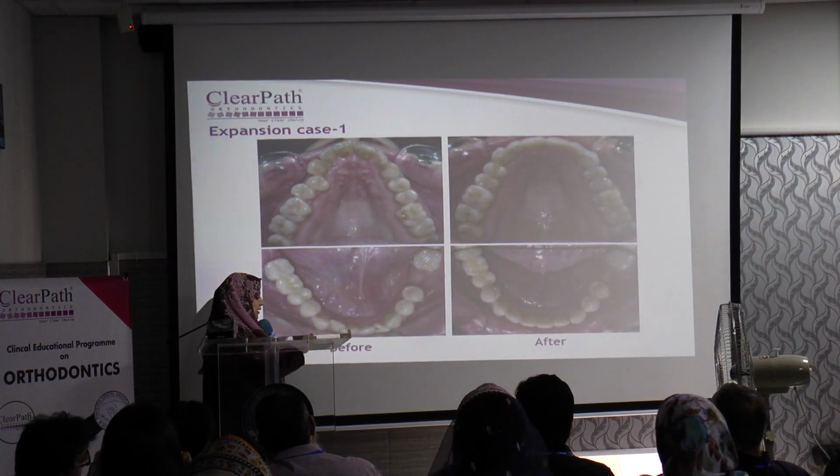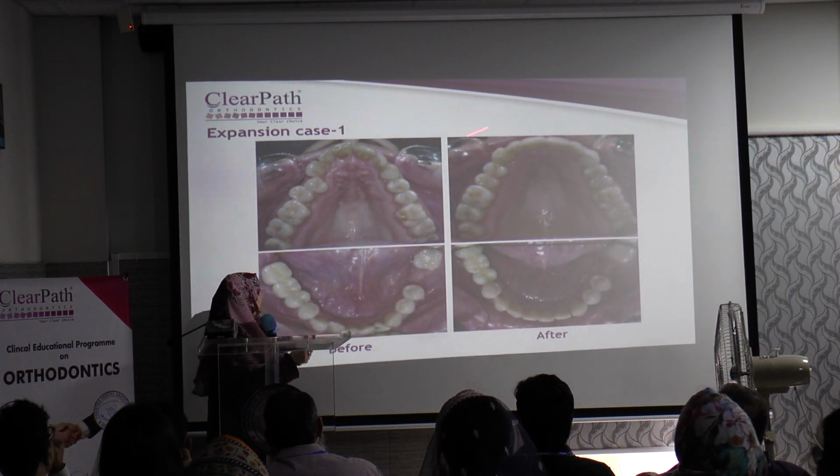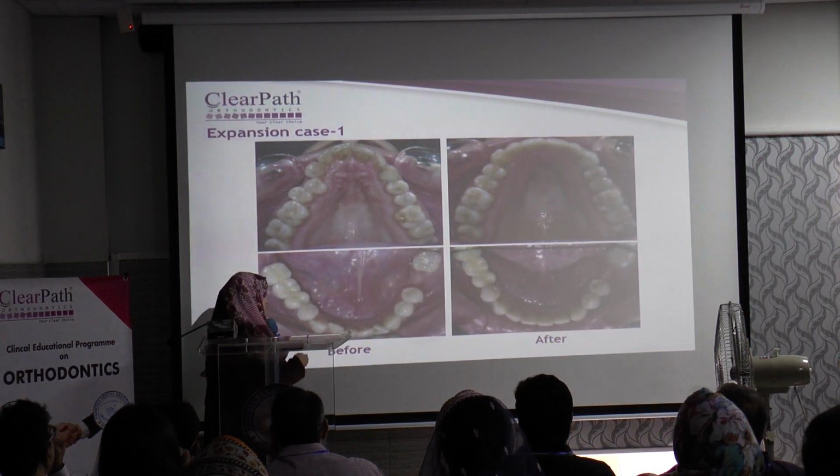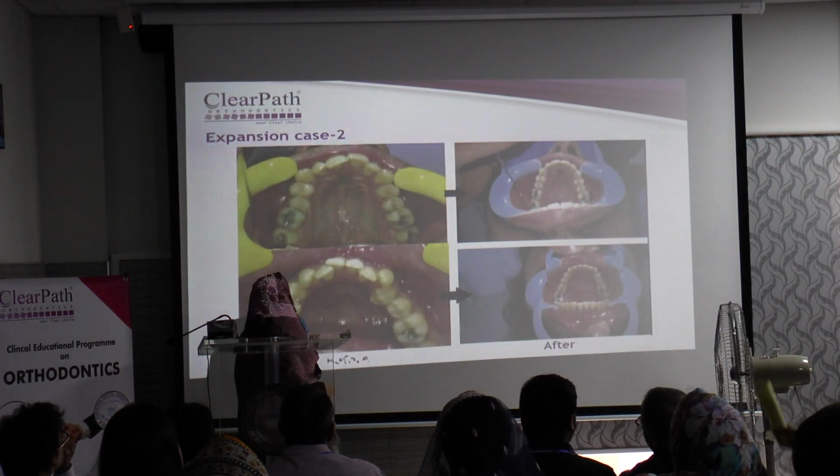Okay. Now, this is another expansion case. You can see the crowding. And that has been treated with this expansion.